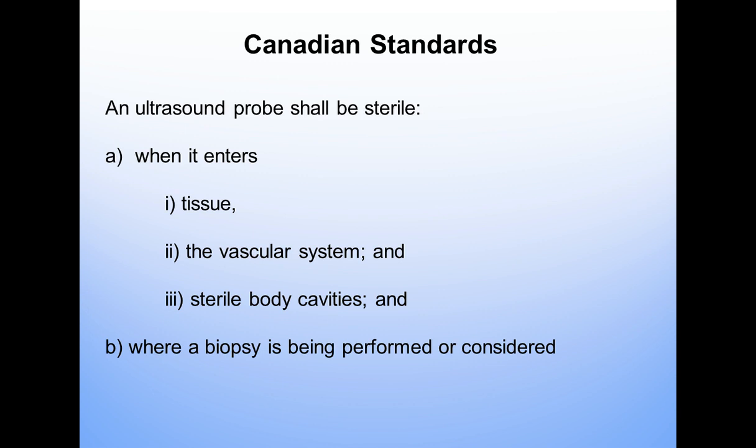Also, where a biopsy is being performed or considered, this is a point that I think is important to spend a few minutes on, because over the years, it's very easy access for physicians to want to have a video ultrasound machine in their departments for whatever they may want to visualize. And so if they're performing biopsies, unfortunately today, there may be occurrences when these probes are not high-level disinfected if they're used for biopsy purposes.